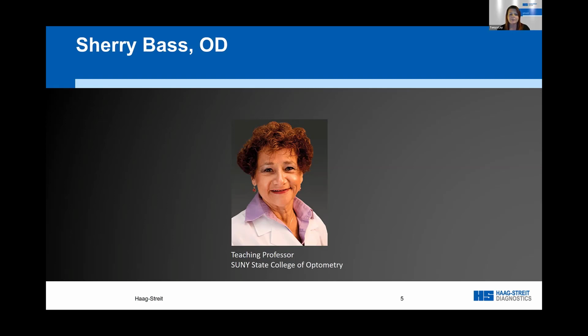Great, thank you. The next question is, what features would best differentiate whether a glaucomatous type field defect is not due to glaucoma? There are some standard, common features. A couple that I mentioned: first of all, if the field defect does not get worse over time and looks exactly the same. Secondly, if it's really, really dense, given the amount of cupping and nerve fiber layer loss, you would know whether you should expect a relative field loss or a very dense field loss. If the glaucoma is not that advanced but you have very dense field loss, it might not be due to glaucoma. And also, as I mentioned before, with the two patients with the sectoral RP, if field defects are not only dense but very symmetric, glaucoma doesn't do that. You expect in glaucoma to have asymmetric field defects, not symmetric ones.